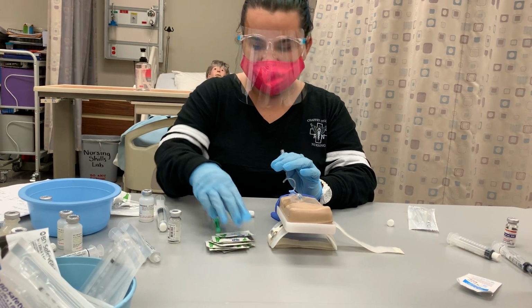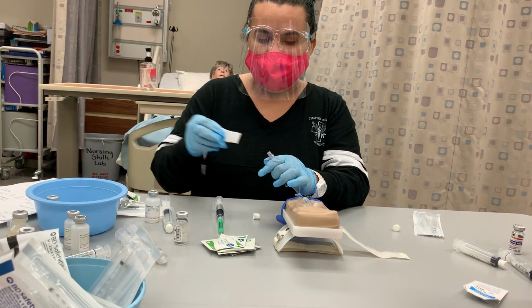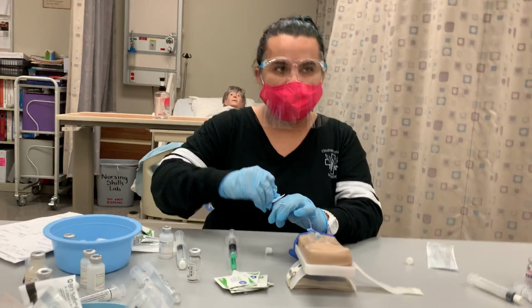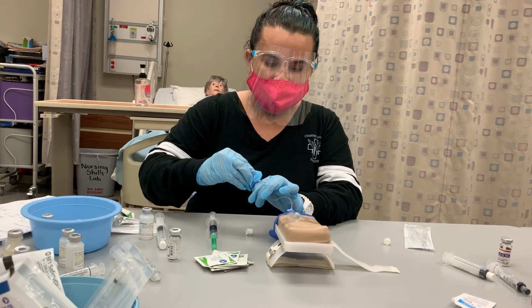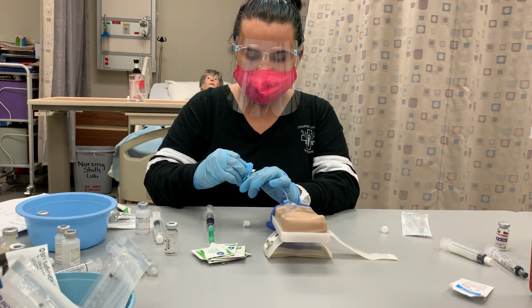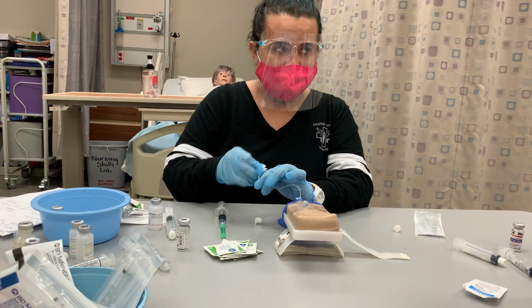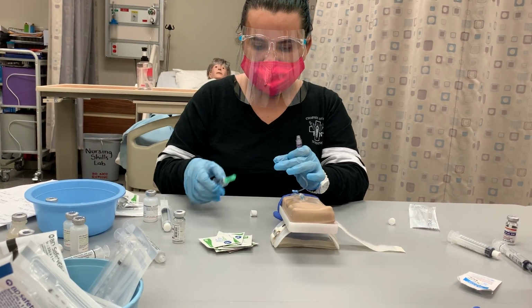So from here again, I will grab another alcohol swab and scrub for 15 seconds. I could use this time also to again check the patency of the IV site. Okay. Once the 15 seconds are up, I could go ahead and throw this away.